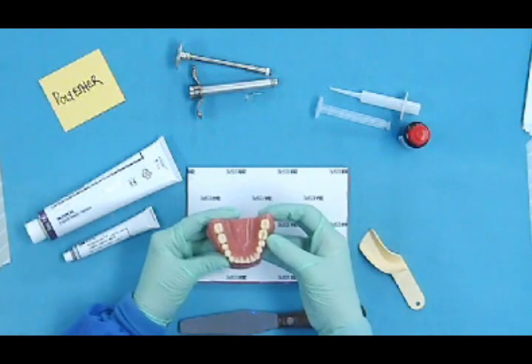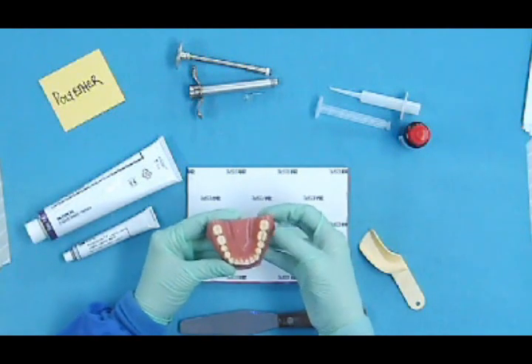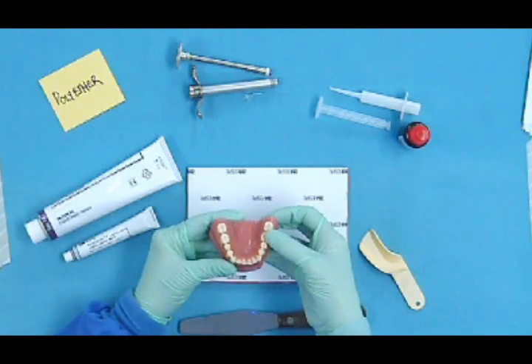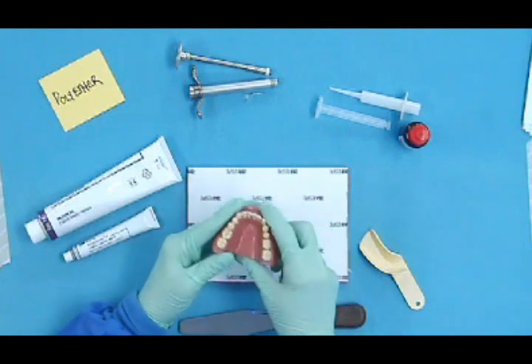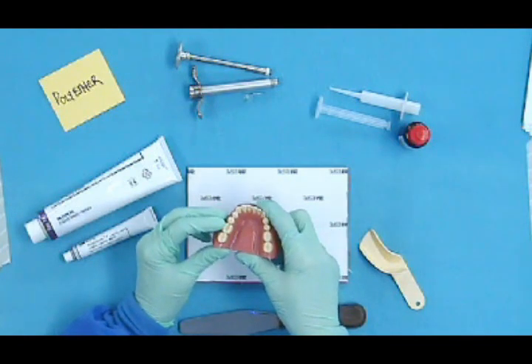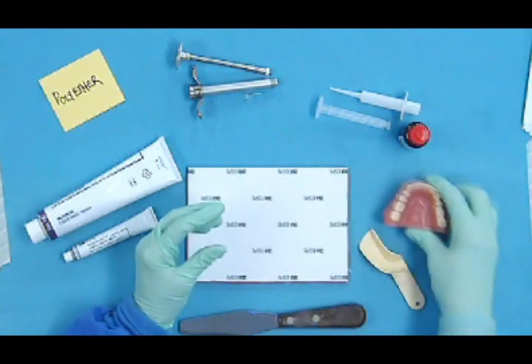On my model, I'm not sure if you can see it, but we've got an inlay prep on this tooth number 19, and we'll be taking a final impression for that tooth, for that inlay.